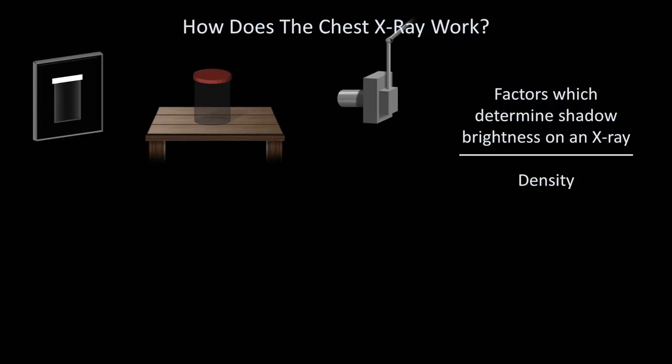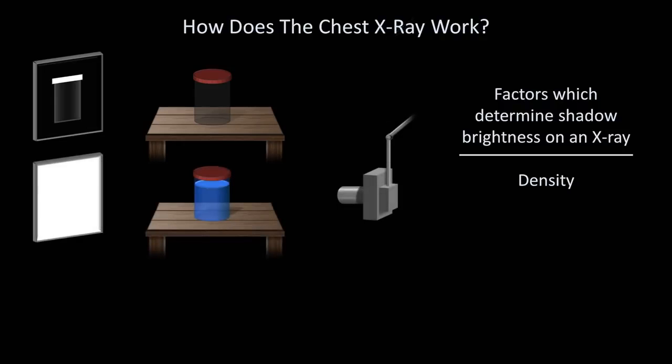Here's some more examples. Next, we can take a jar of water and do the exact same thing. Expose it briefly to X-rays, which also exposes the film behind it. In this case, water is denser than air, so it blocks more X-rays, and therefore the jar's contents now appear gray on the film. It's important to realize that even if the fluid in the jar is completely 100% transparent, it will still block X-rays and therefore look gray. The fraction of X-rays a substance blocks has absolutely nothing to do with its color or degree of translucency within the visible light spectrum.